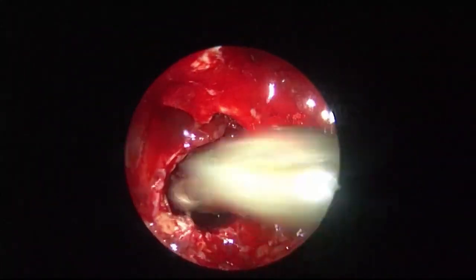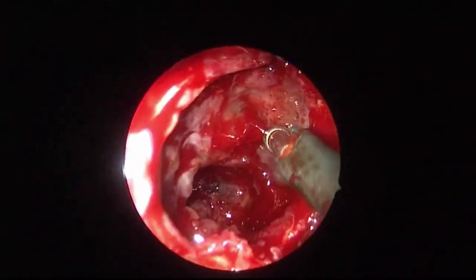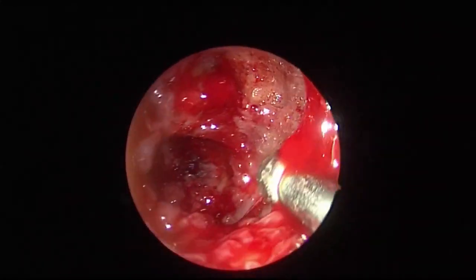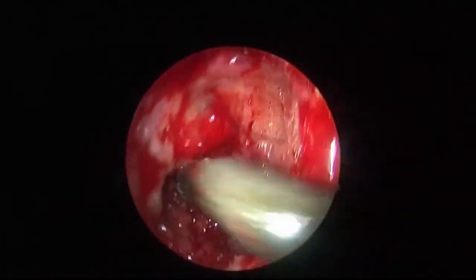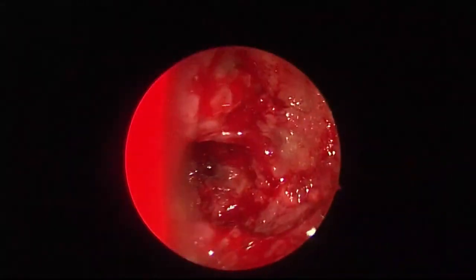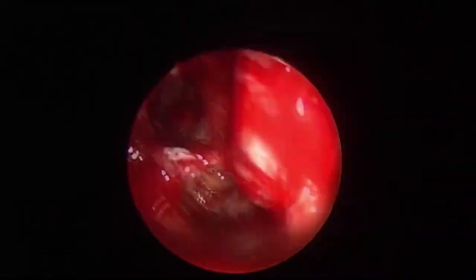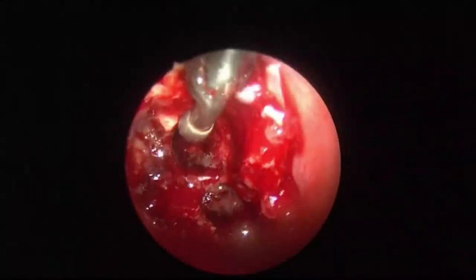And this is your clival recess. This is the intersinus septum, opposite side. See the septum. See the intersinus septum. This is the clival recess. This is the sella above this one. And the complete interior of the sphenoid. See that? Yeah, very clear. And now finally towards the frontal. See the frontal, we have already seen a lot.